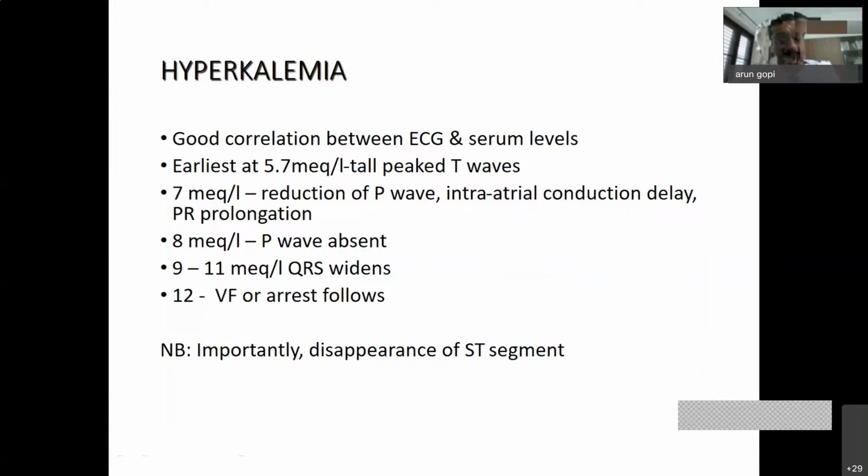So when you have tall prominent T waves, if they are symmetric, narrow based, and pointed, it is hyperkalemia, while if you have symmetric, broad based, and not tented, it is a sign of ischemia, while if they are asymmetric and not narrow, it is considered a normal variant.